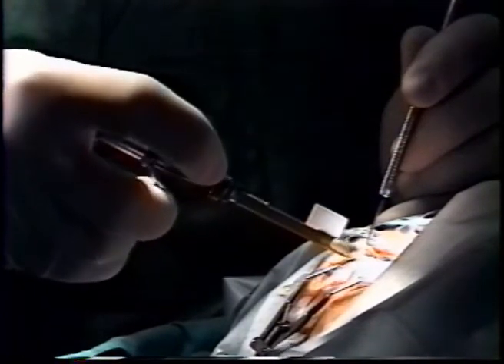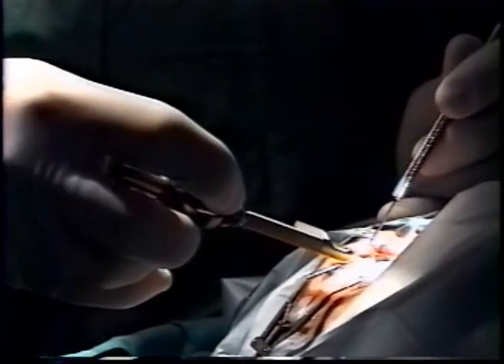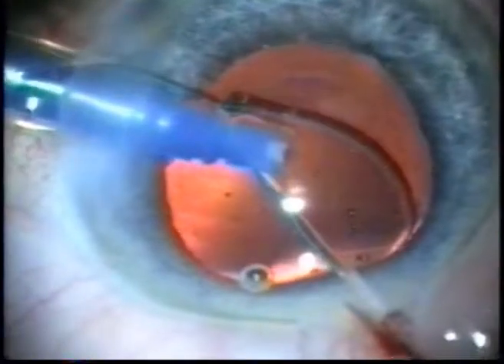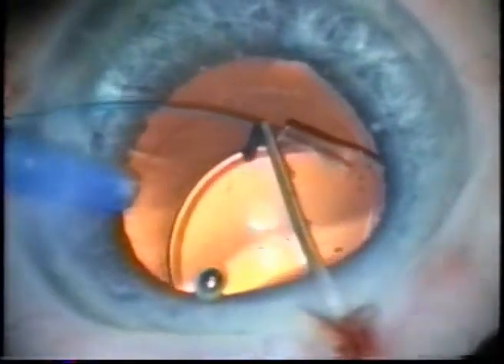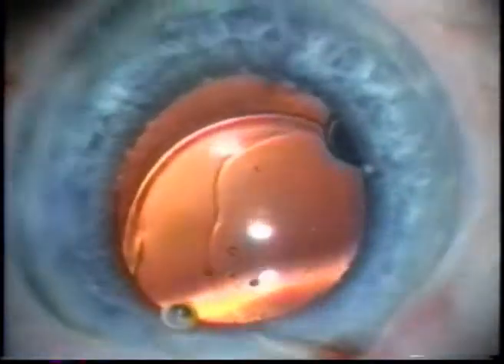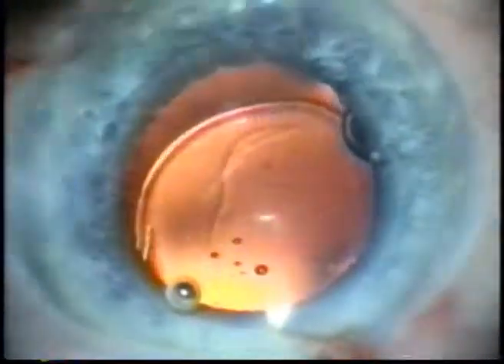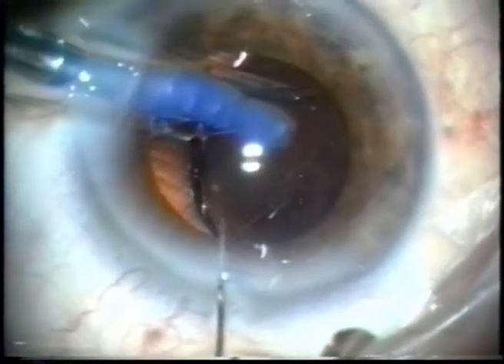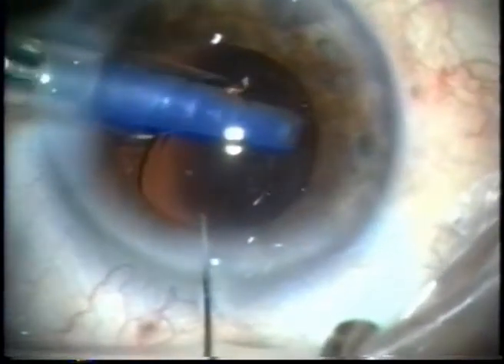The injector is rotated while ejecting the lens to properly align the IOL components with the capsular plane. The opposite hand stabilizes the globe and helps to release the trailing haptic into the capsular bag, as there is no back-and-forth plunger action to help release the trailing haptic. The device allowed a controlled injection by converting a centripetal displacement into a precise forward displacement of the IOL pushing plunger.